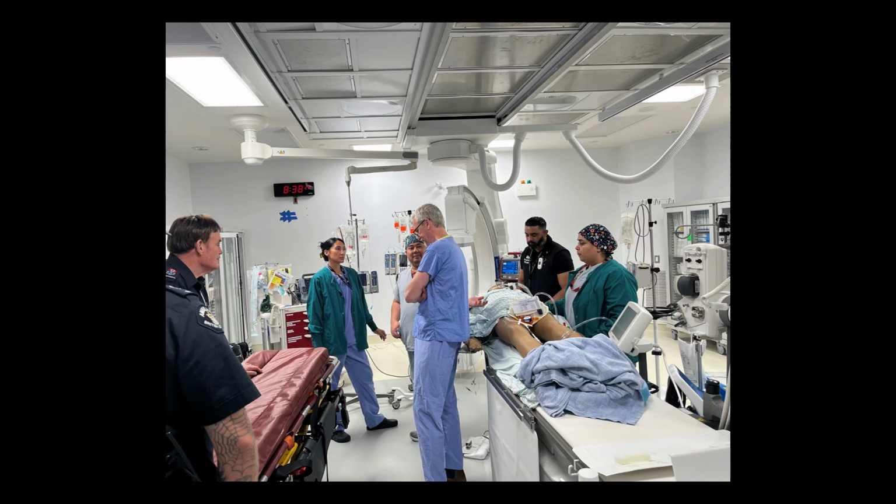On arrival to the cath lab, you will want to receive handover from the cath lab team and the interventional cardiologist on the patient's history and clinical course. At this time, you will help stabilize and prepare the patient for transport.